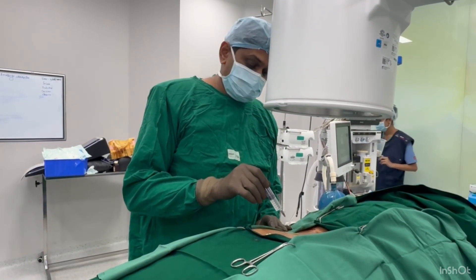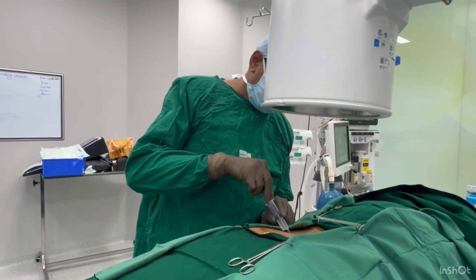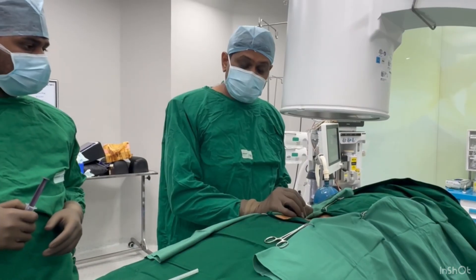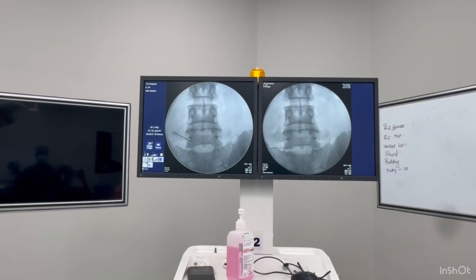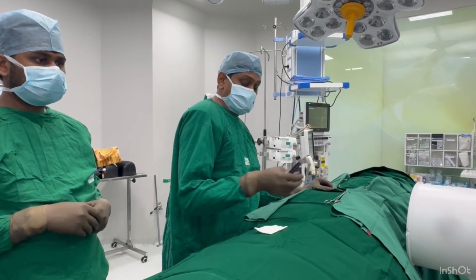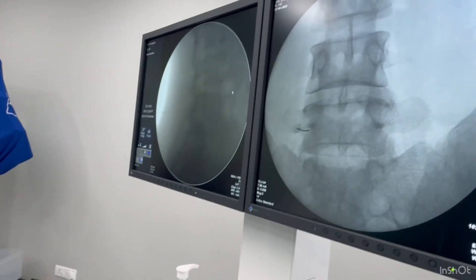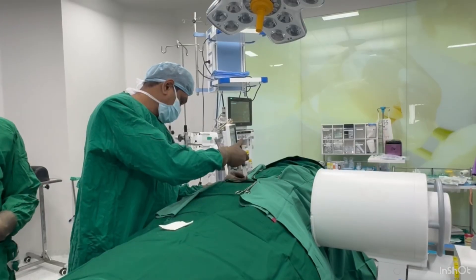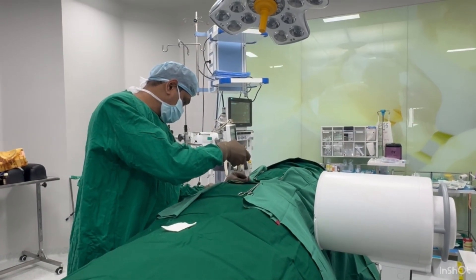We are now going to give an L4/5 nerve root block on the left side. I am giving local anesthesia now. After local anesthesia, we are placing the 22-gauge spinal needle at the L4/5 foraminal area, under the L5 pedicle, checking in both AP and lateral views. Once the position near the L5 nerve root area is confirmed, we will inject the same solution: bupivacaine plus dexamethasone.